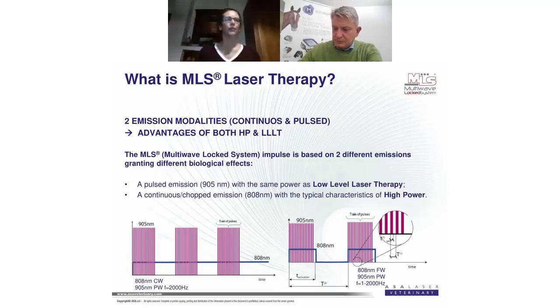But what I can do is to reduce the inflammation that is still in the structure, and to help from that moment on. So if I have a calcification, around the calcification there is always a point of inflammation, because it is a point where there is no elasticity. So with the laser, I can reduce the inflammation around the calcification, and in a certain way, I can help anyway with the chronic situation.